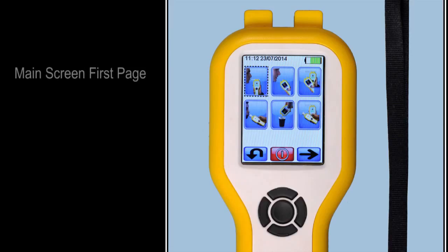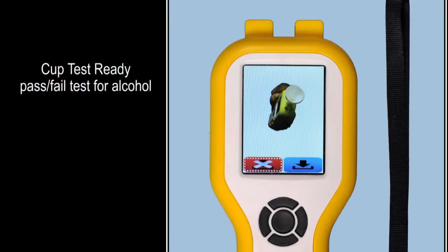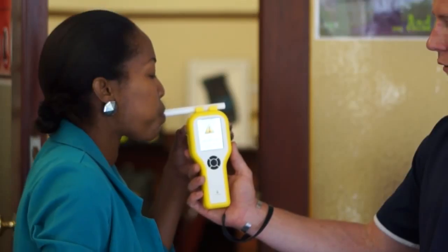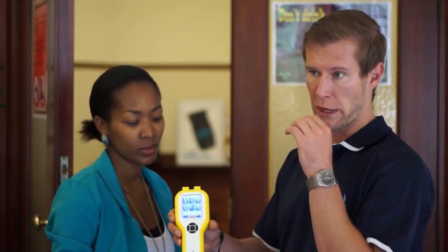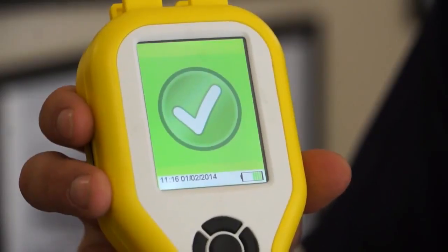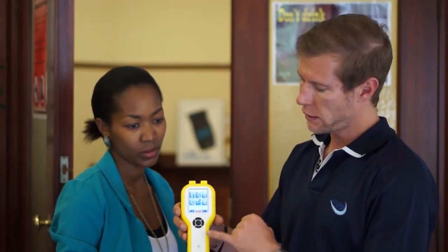It now brings up different options for testing. We've got an option to do a test with a mouthpiece, an option to blow directly onto the instrument, or to get a pass-fail test that doesn't need any mouthpiece at all — and that would be a screening test.